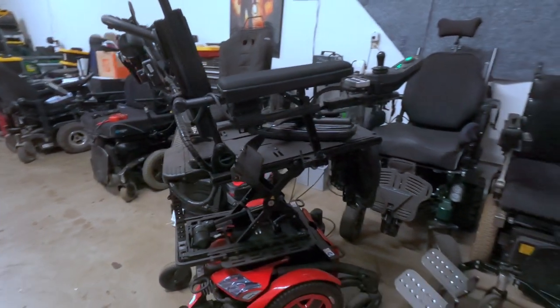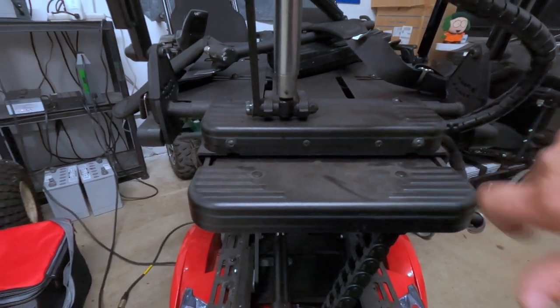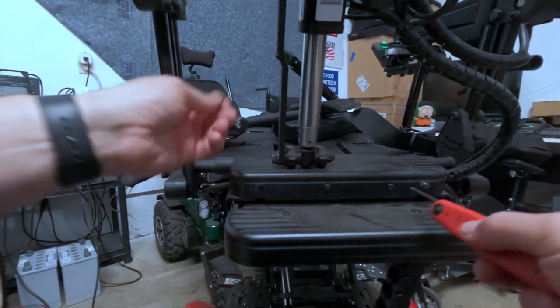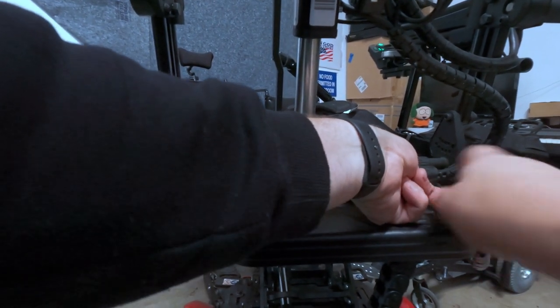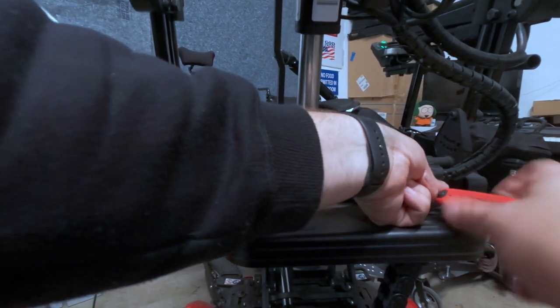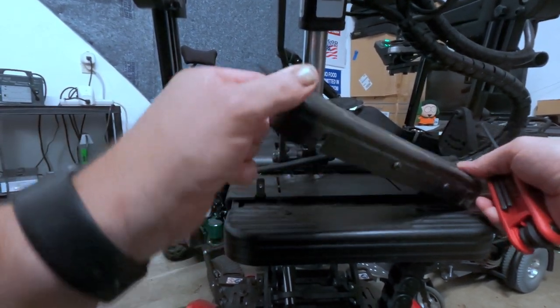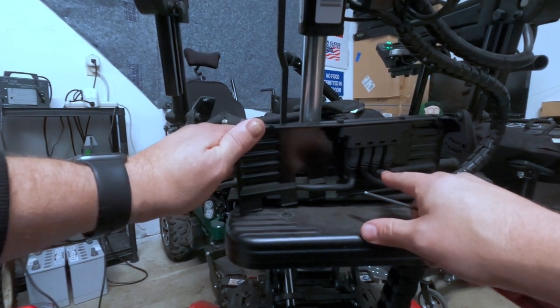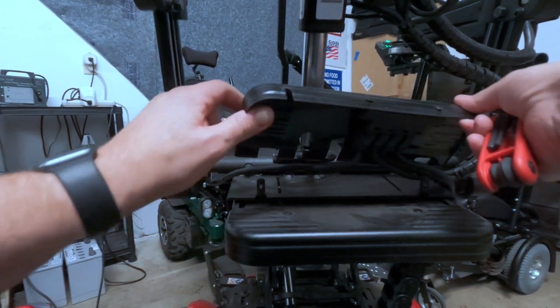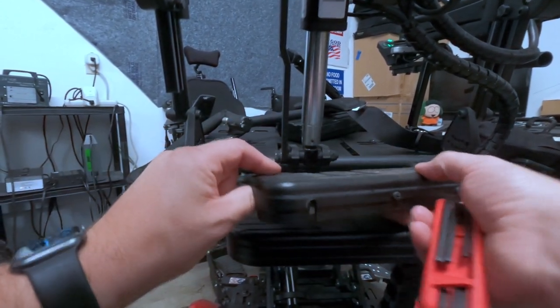Looks like we've got some — are those Torx or Allen? I think they're just rounded-out Allens. Yep, just Allen screws with a lot of miles on them. They don't have to come all the way out — there's a little slot. Looks like something else is screwed on in here, like some wiring — a little cable hub. These cables are huge. I guess we can unplug — let me turn the chair off first.